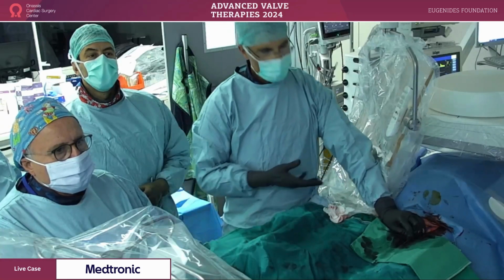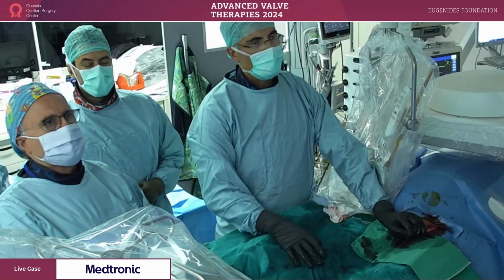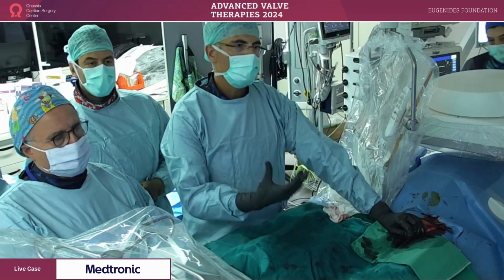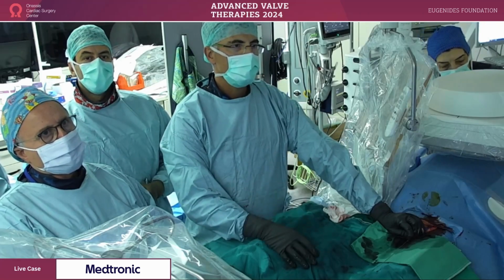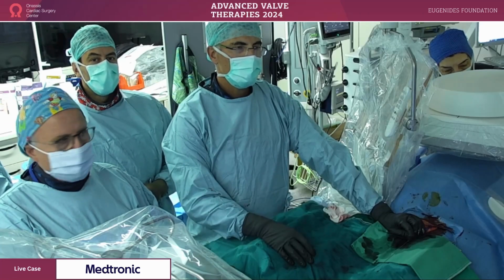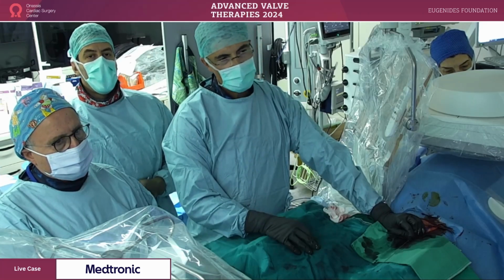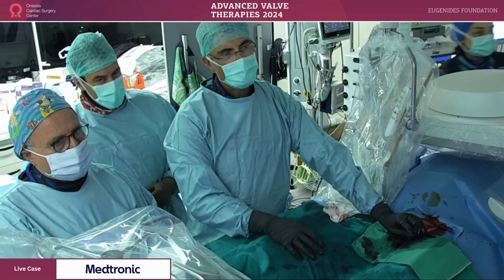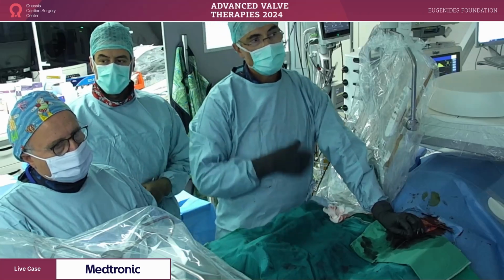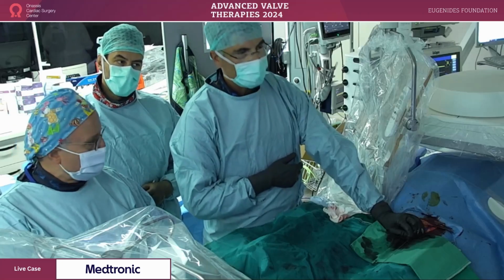This patient was scheduled, after the CT, to do a right femoral approach, but we spotted a big chunk of calcium, quite larger than seen in the CT, on the inferior wall, and maybe obstructing the way of the ProGlide. So we decided to go to the left femoral and do a little bit higher puncture to avoid the calcification there as well.